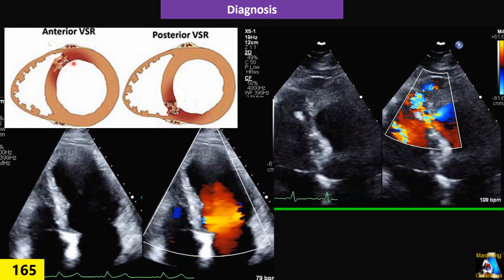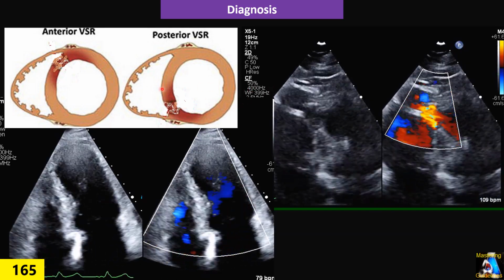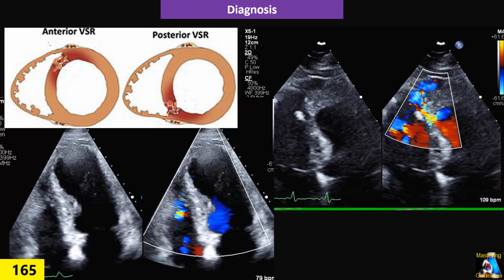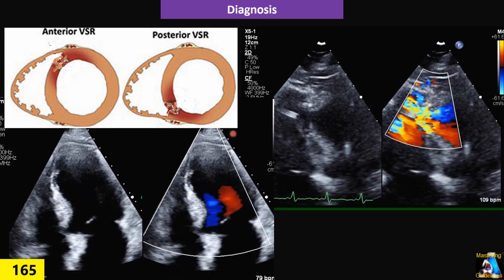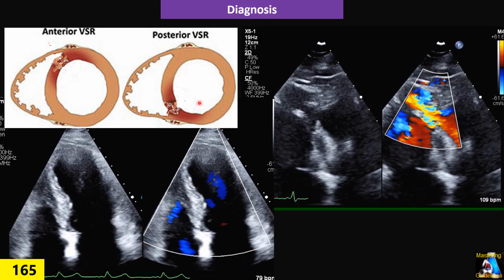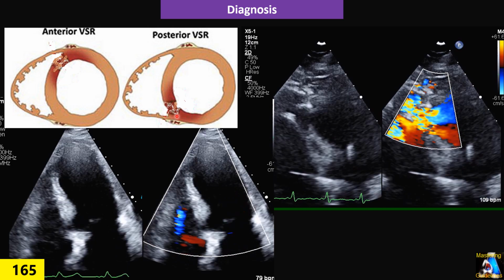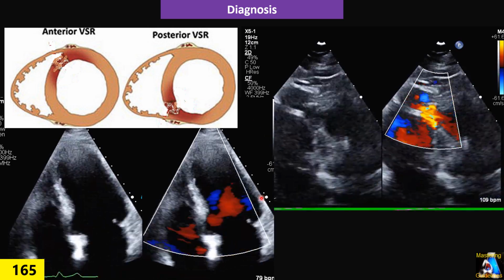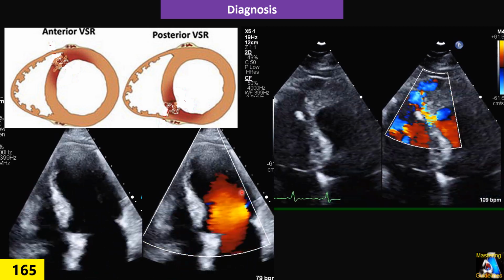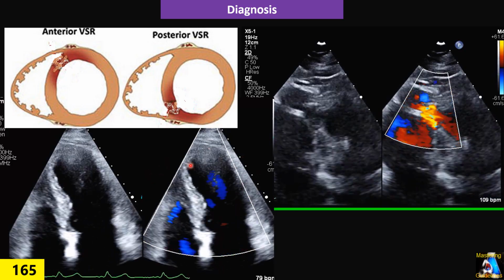This view, with the little fan, is completely out of the axis. Or on this one, posterior at the base, in all the classic views that we have, four-chamber, this one is off, we cannot detect the jet here. For apical 3, this one we miss it. For apical 2, this one we can miss very easily, the posterior type of VSD.